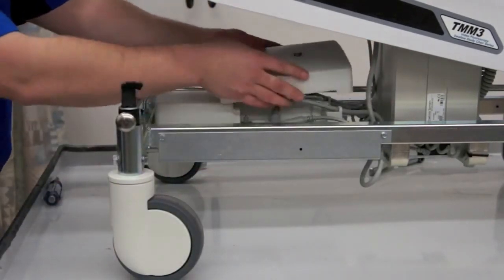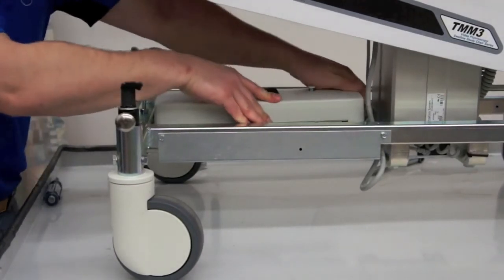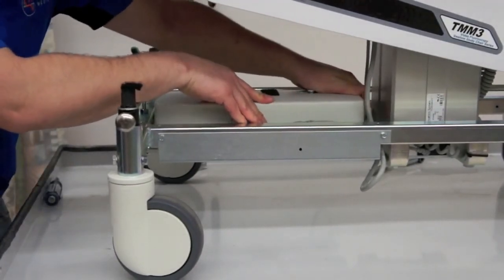Place the control box cover on the back end first, then push down on the front while pulling back. You'll feel the control box cover slide into place.